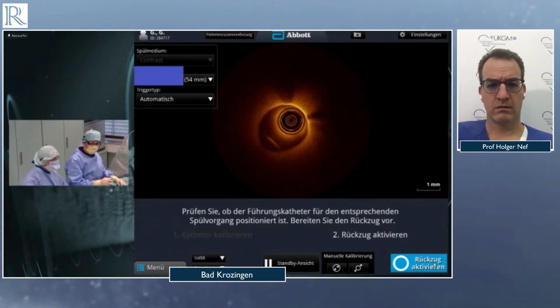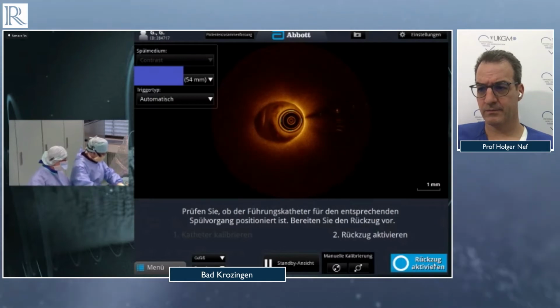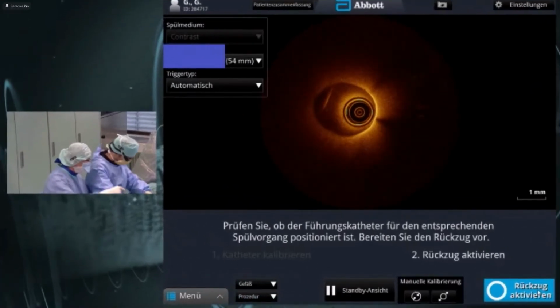So we do OCT again now, and you can see live how it looks.